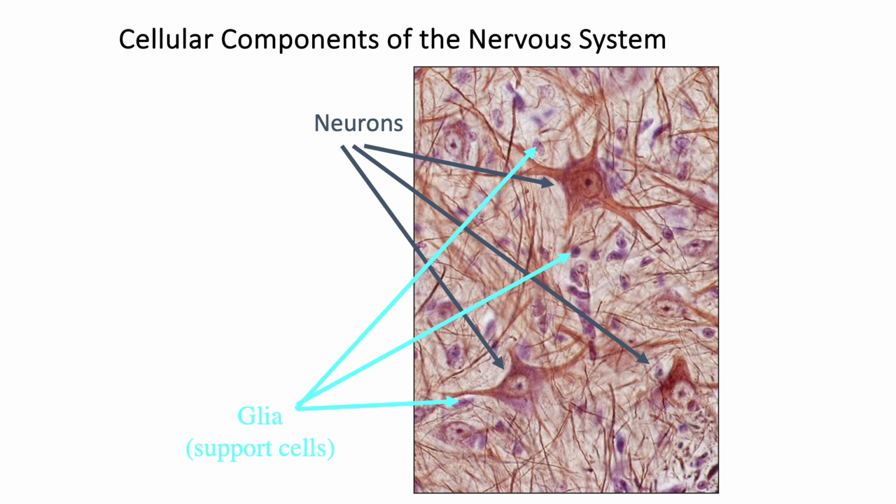You can also see a mesh-like structure in the matrix. Okay, so you have connective tissue with glial cells, which are supporting cells. Some of the supporting cells are indicated by this arrow. You have another one here. So there are about 3 of them which have been shown, but there are several of them which do not have any arrow pointing at them.